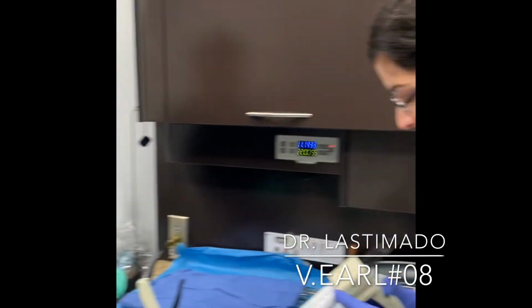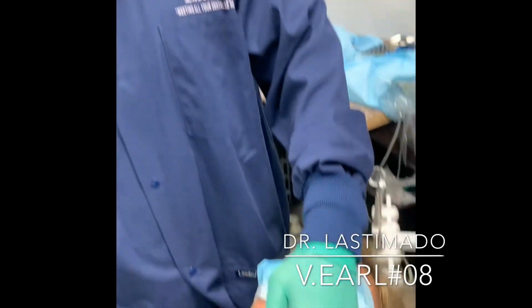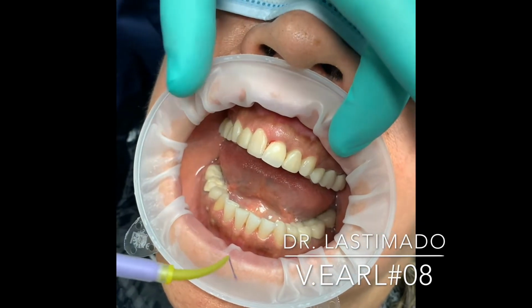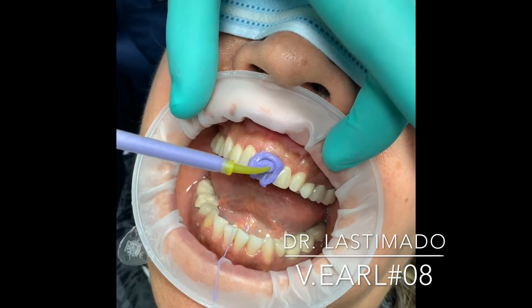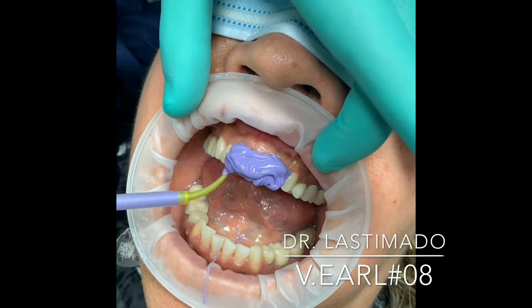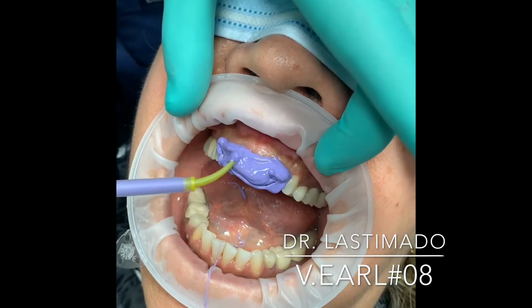Okay, so all we do here, I have my great chairside assistant here, Alicia from Hyacinth. Thank you, Hyacinth. We have our Optragate in place, as you can see, and I'm just using some PVS impression material. Yep, go ahead and fill, and I'm just going to capture the line angles, and we'll show this step by step. We're just going to take a preliminary impression, not anything too fancy, of this area.